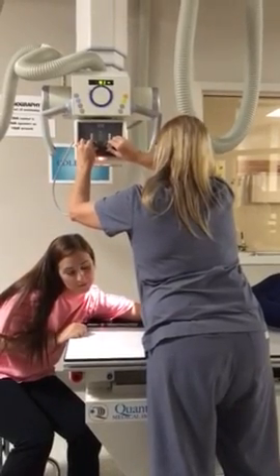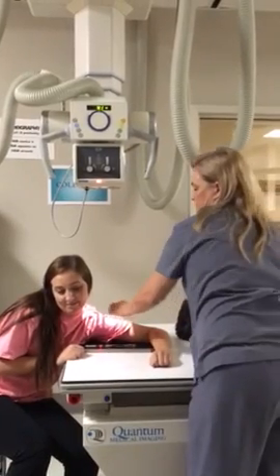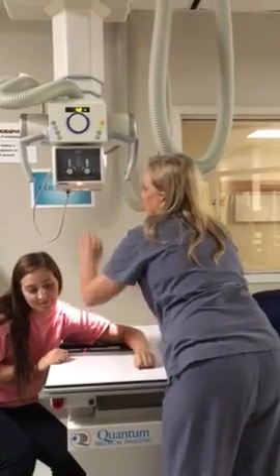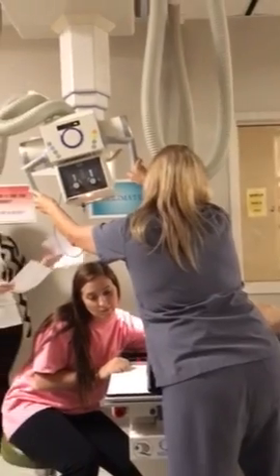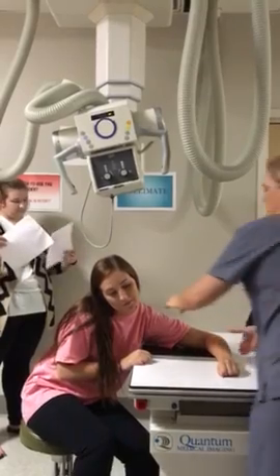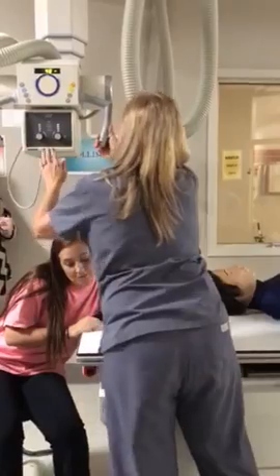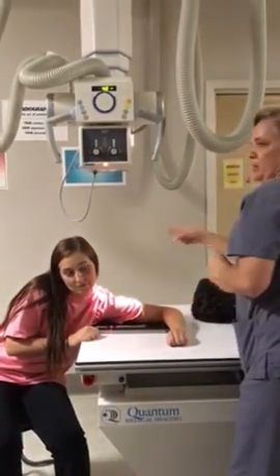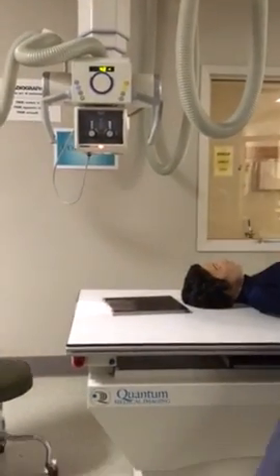Okay, this is superior to inferior. And so she's got her arm enough that you don't have to angle. Okay, this is pretty much on there. Now, if she was up a little bit, then you would have to angle, depending on how much. Does everybody understand? If they're able to lean across, you don't have to angle. Right through the joint. And that's superior to inferior. Okay. Thank you, ma'am. Alright, so what are we missing?